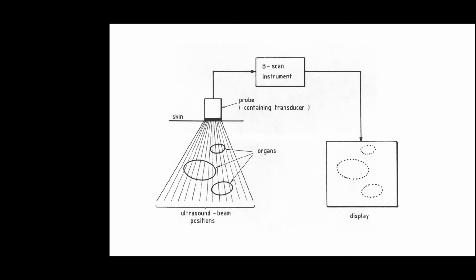And because this is just ultrasound at the powers that it is applied to the human body, clinically it has no harmful effects that have been measured up to now. Now, this would be a two-dimensional scan, and still the majority of probes and ultrasound systems used in the clinic are two-dimensional. As I said, this is the most widely used imaging modality in cardiac medicine, and in a great majority of cases, it is done in 2D.